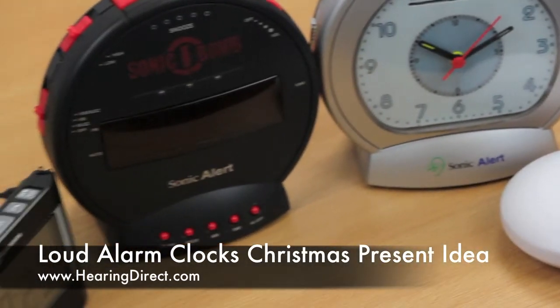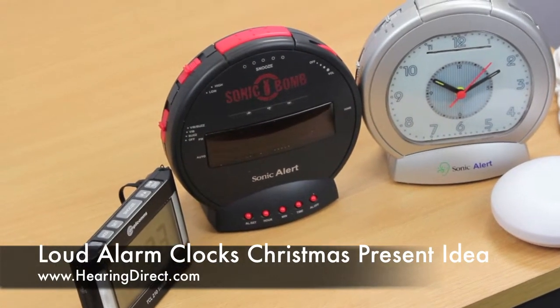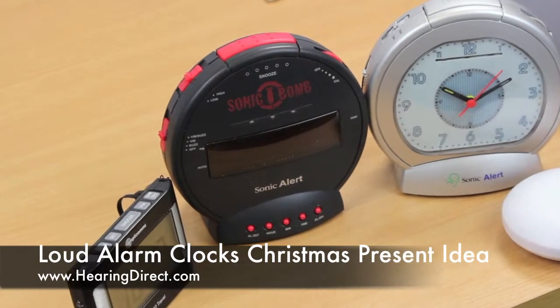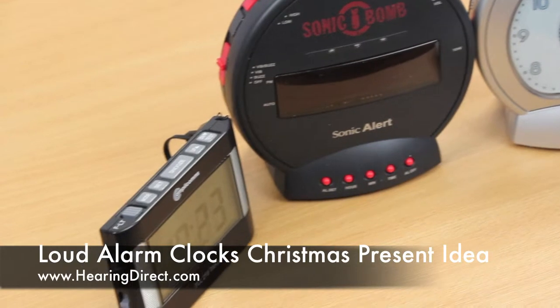There are also alarm clocks if you don't need or don't want the wire going from the alarm clock onto the pillow. Amplicom do have two alarm clocks with wireless shakers that can be connected.